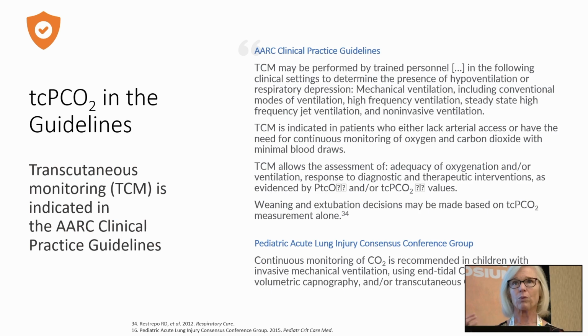So between our clinical judgment, between having that objective value of the transcutaneous measurement, we can hopefully decrease our blood gas draws, speed up our weaning process, speed up our extubation process, hopefully not even intubate in the first place, thereby decreasing the patient's overall length of stay, their mechanical ventilation stays, exposing them to the risk of pneumonia because they're mechanically intubated.